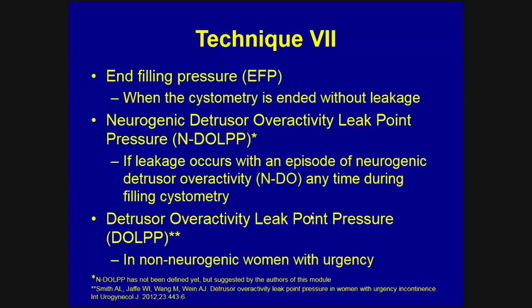If leakage occurs with an episode of neurogenic detrusor overactivity anytime during filling cystometry. In non-neurogenic patients, it has been previously defined as detrusor overactivity leak point pressure.